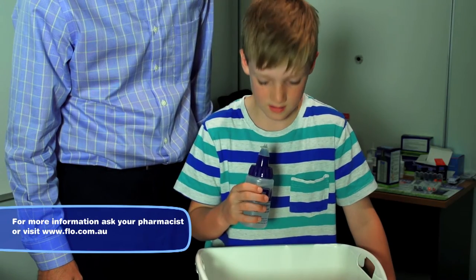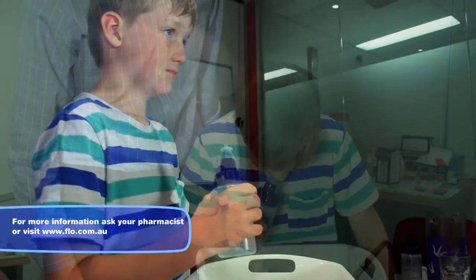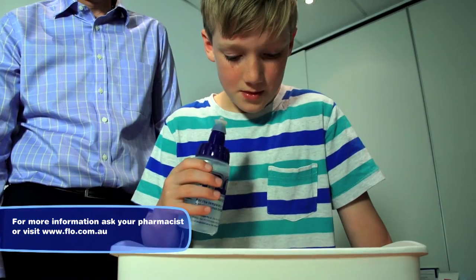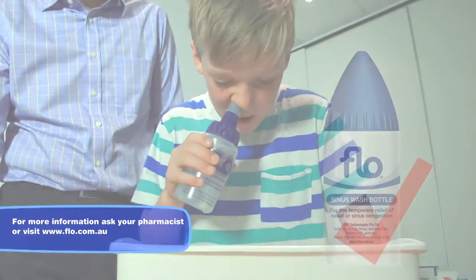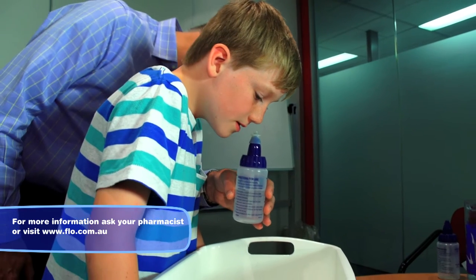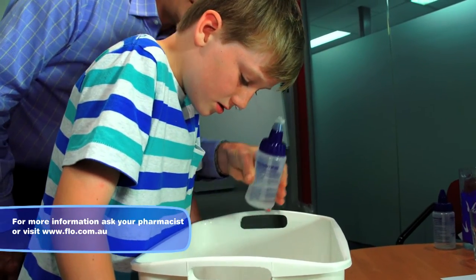Ask the child to put their chin on their chest and lean over a basin. Next, ask them to start panting like a dog would do. This maneuver helps to ensure that the wash fluid travels around the nasal and sinus cavities and exits the opposite nostril.